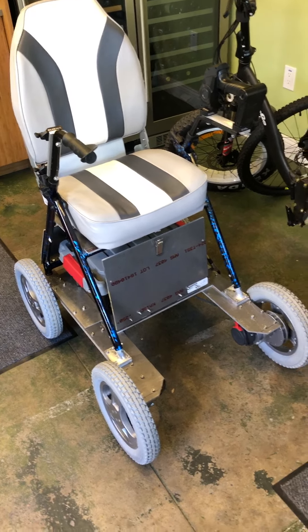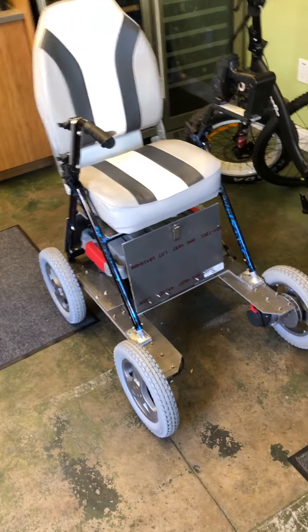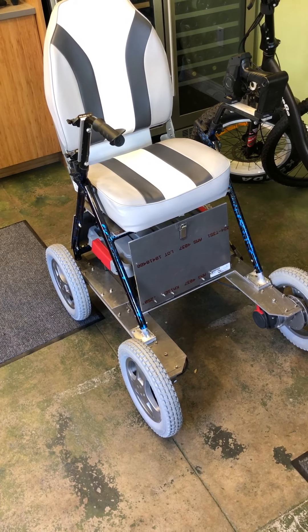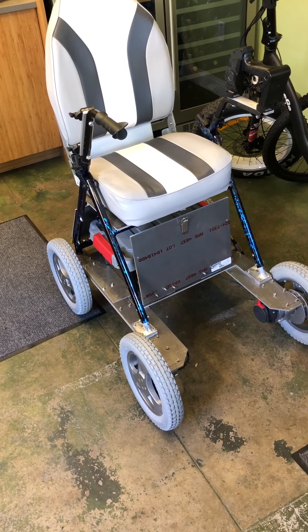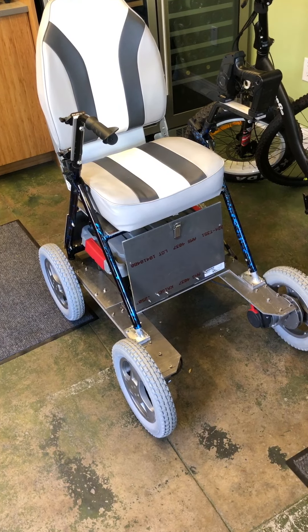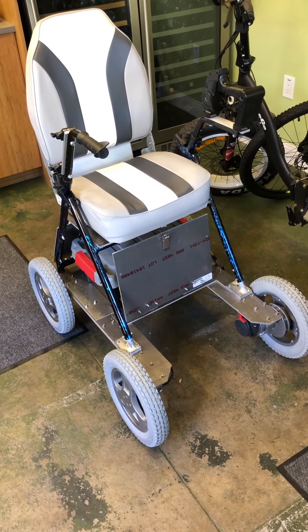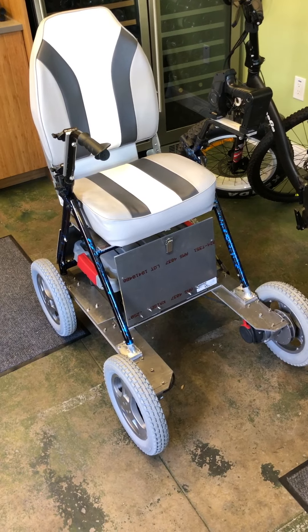This is my documentation of a crazy project. This is to be both a seated scooter and walker, which meant that I needed to have controls that would work both in the forward and reverse direction.